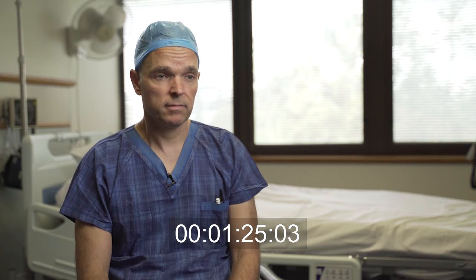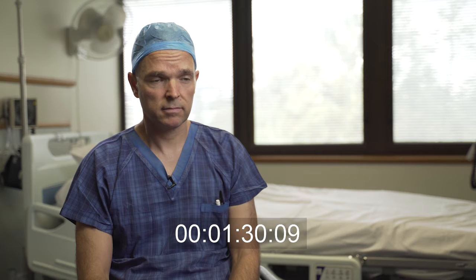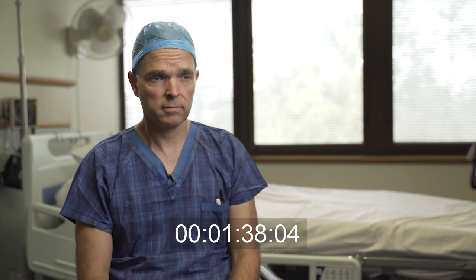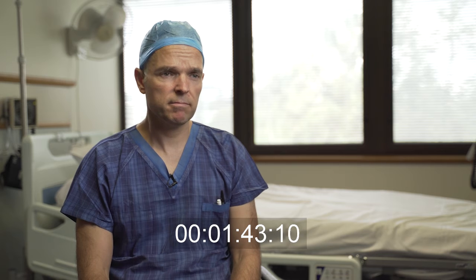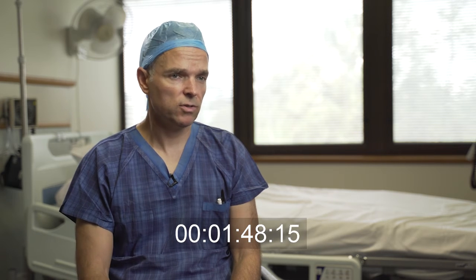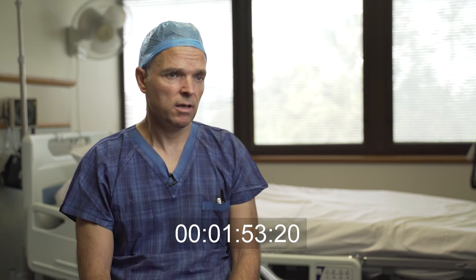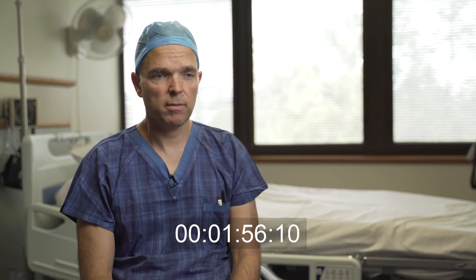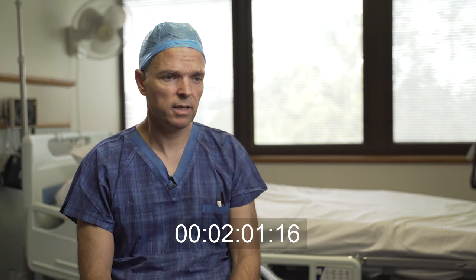Brilliant, thank you. You've covered benefits already, I think. Have you ever had any feedback from patients or staff in relation to the use of OptiFlow? It's well tolerated, I think. Initially the patients may take a while to get used to the high flow through the nasal prongs, but it's well tolerated. I think often people don't get sleep apnea masks because they can't tolerate the masks, and I think it's a lot easier to tolerate than that.